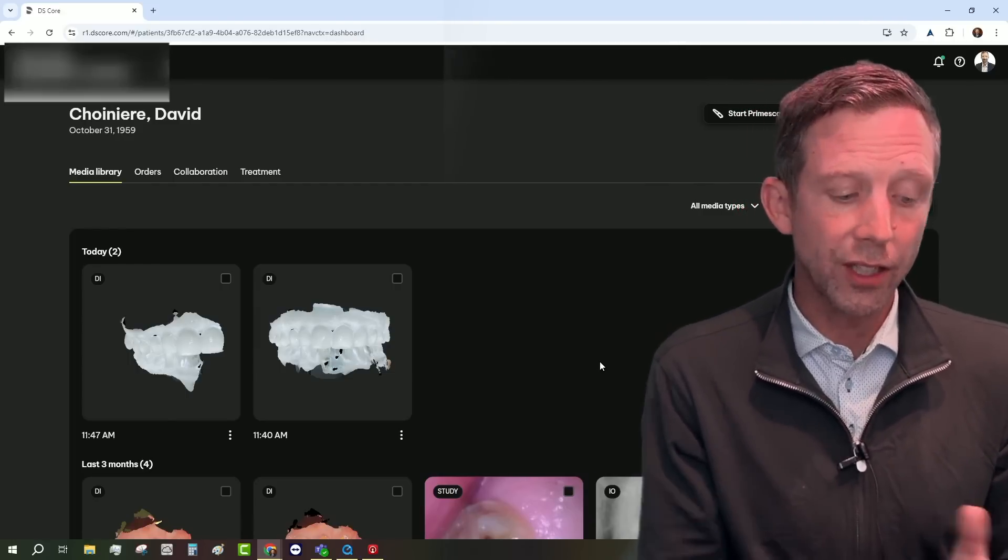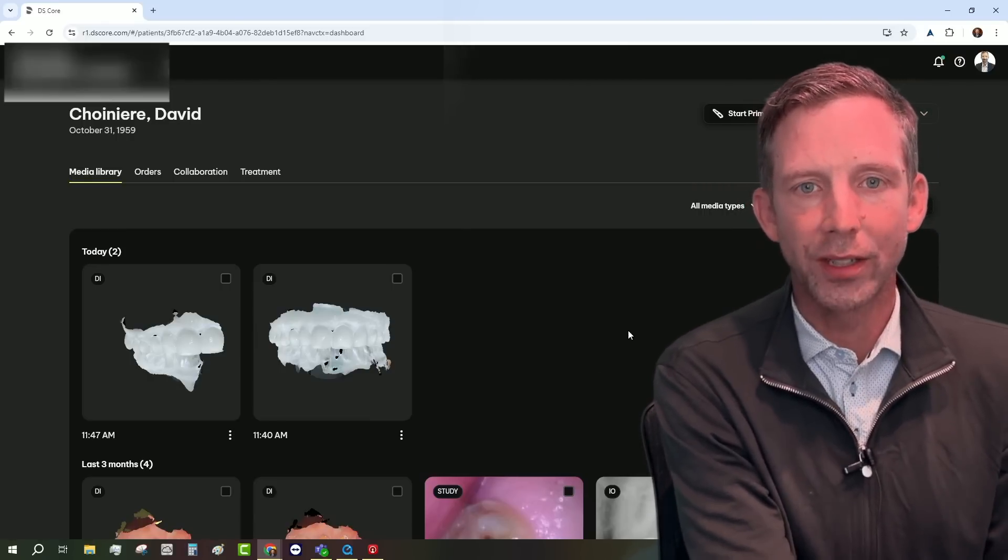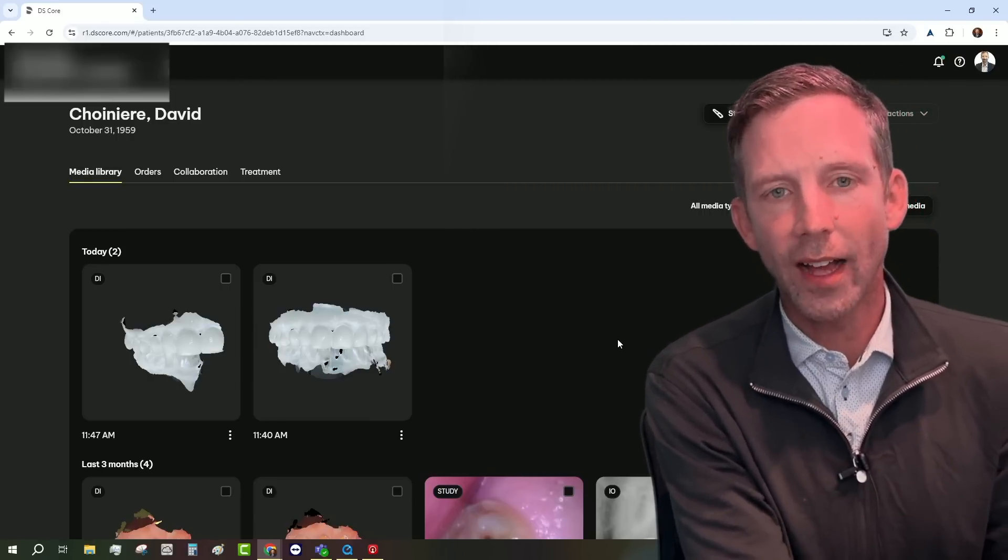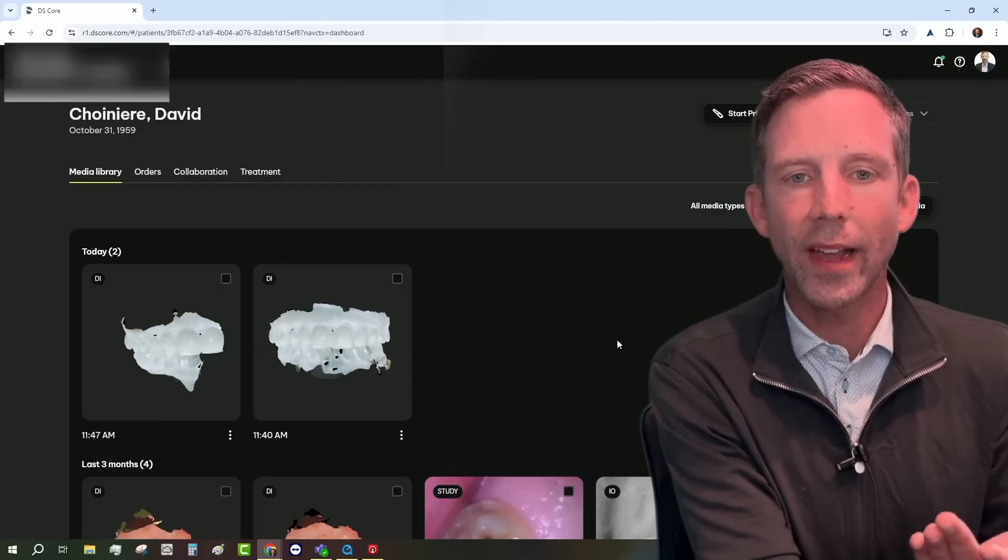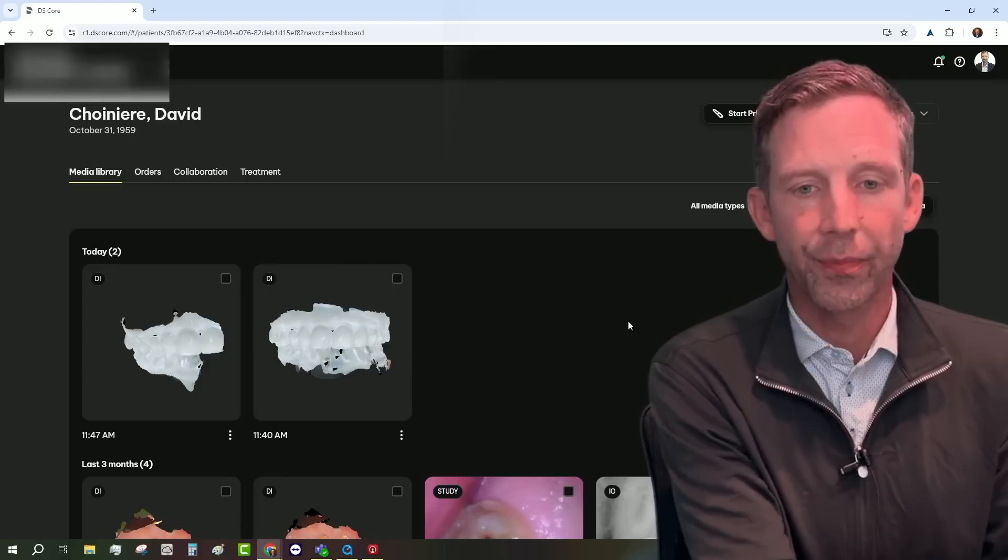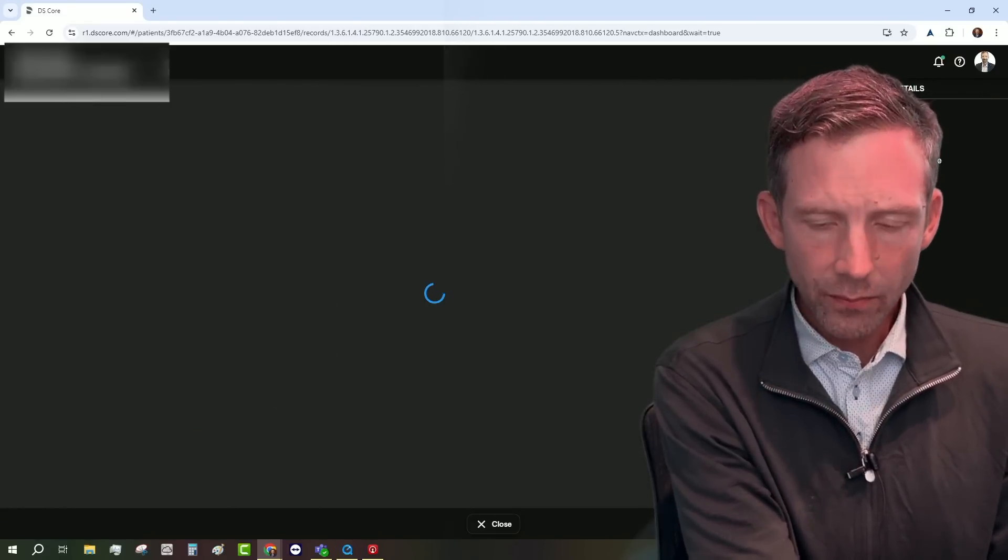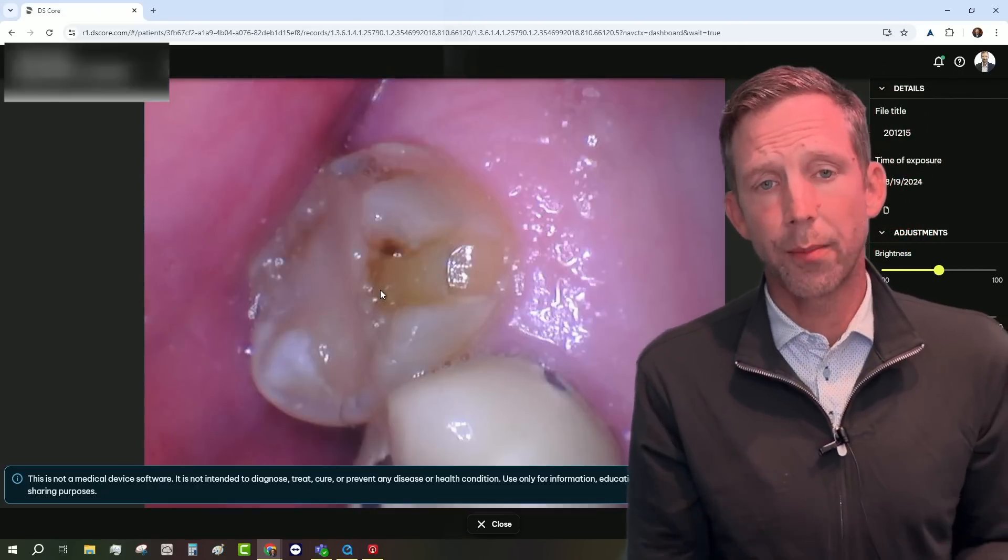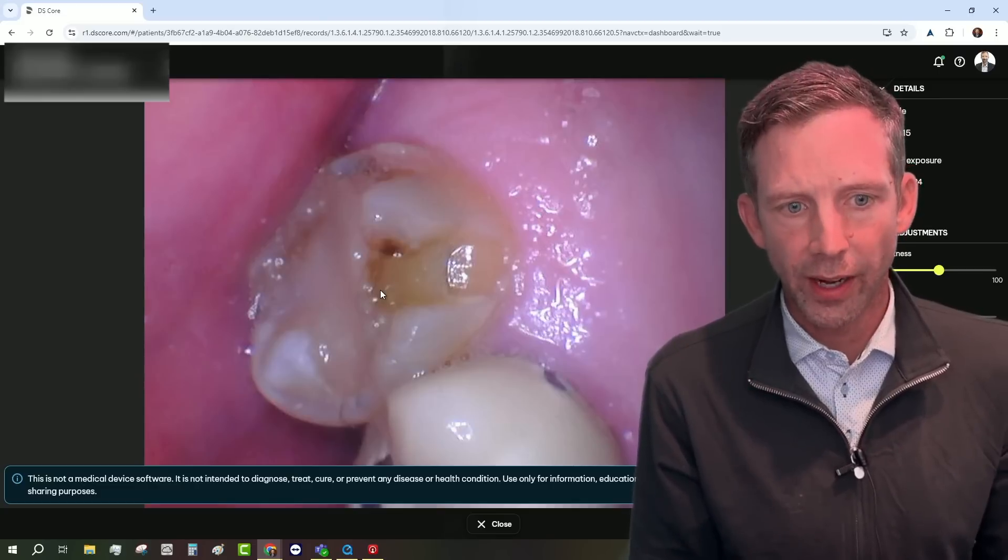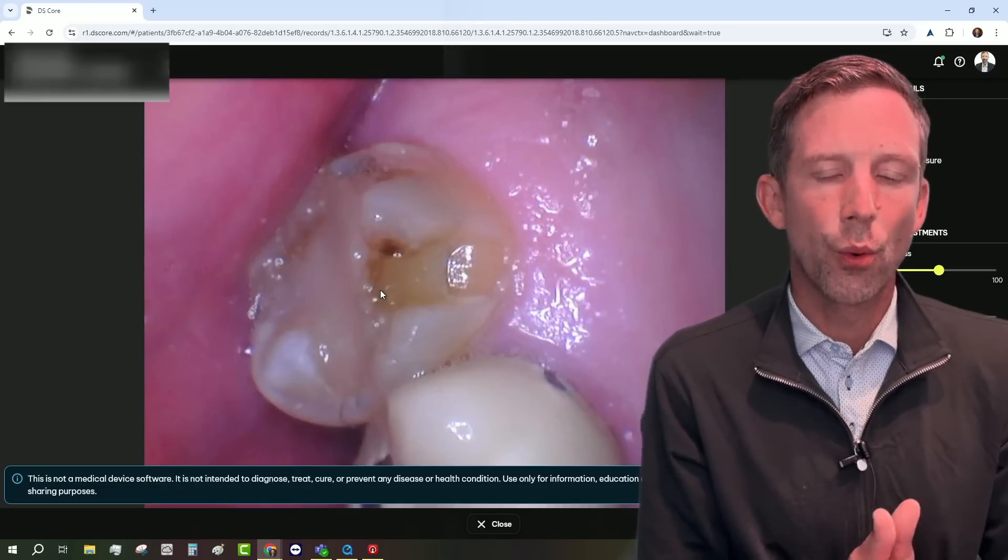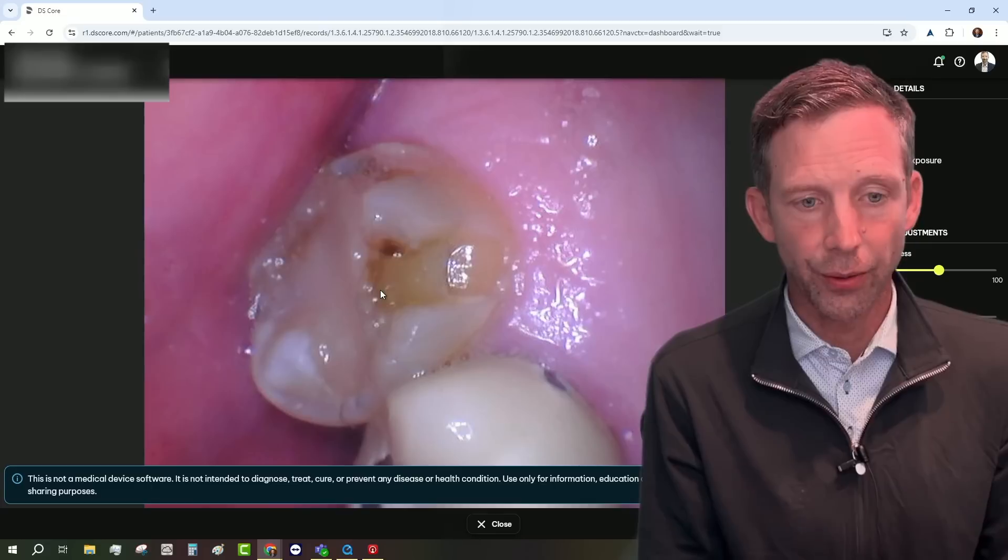So let me really quickly show you what it would look like if I was going to scan a live patient, and utilizing the status scan as a way to make my treatment scan a little bit quicker. So we're actually going to scan this patient. This is actually the tooth that we're going to be treating. It's tooth number 15. You can see big composite restoration, broken lingual cusp, a couple cracks. We're going to do a full coverage restoration on this particular tooth.